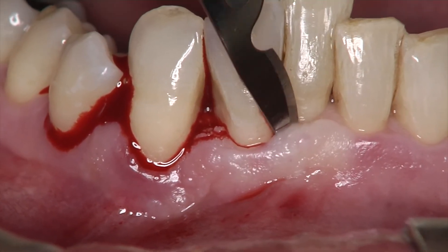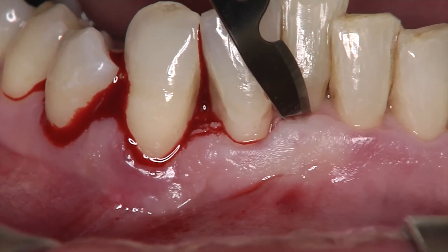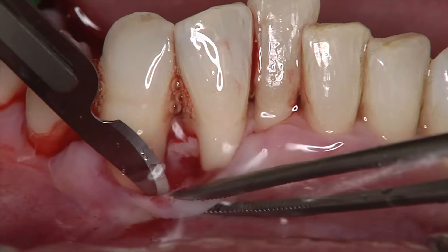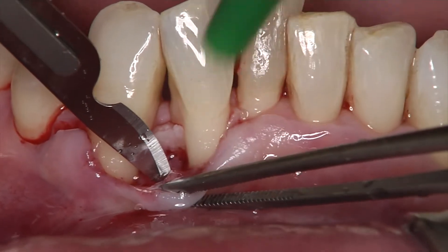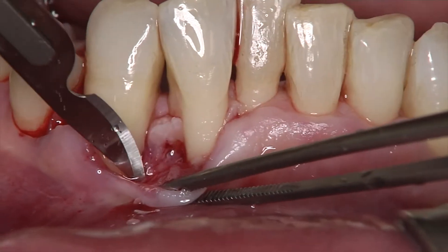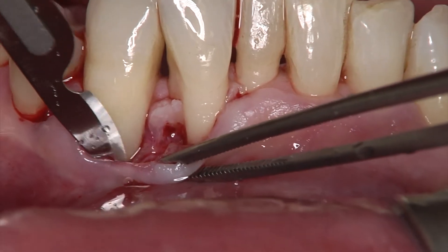The flap is extended mesially and distally by an intrasulcular incision, along with a beveled incision of the papilla on the adjacent teeth.